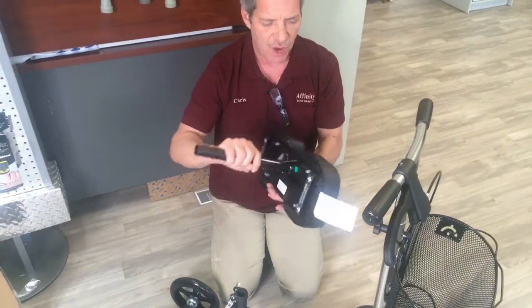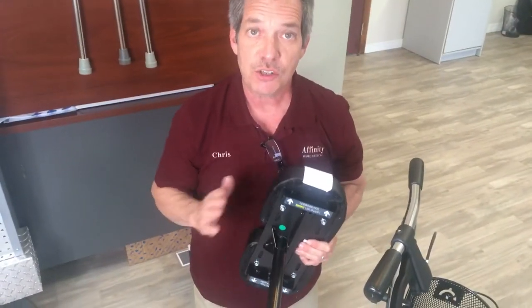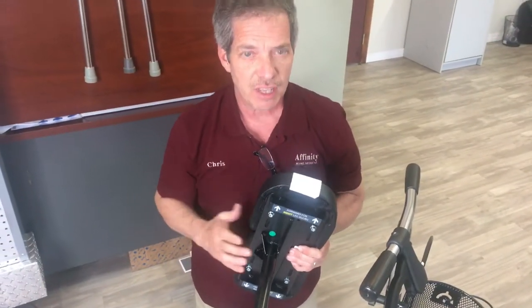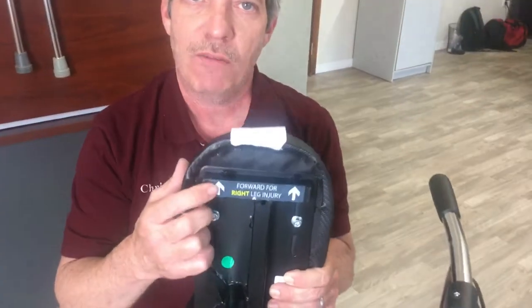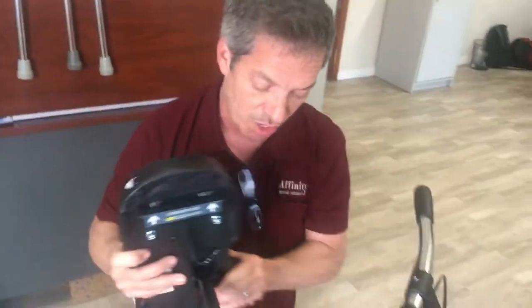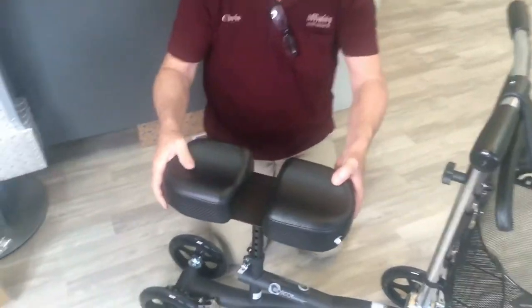With the seat on the Roscoe scooter, I want to point out something very important for your center of balance as you're using the knee scooter. This side forward when you have a right leg injury, and flip it over — this side forward when you have a left leg injury. So we're going to say that you have a left leg injury, and I'll place it in there with that left side forward.